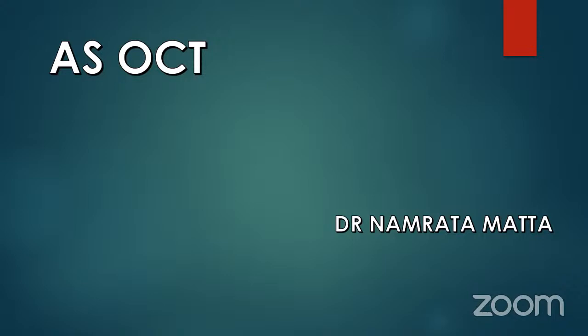Which Placido-based topography do we use? Topcon is there. Not Topcon, TOMI is there, I think. TOMI topography, and any other? In Sangli, which machine do we use? Sirius, sir. Sirius Pentacam. So Sirius, what is the technology that is used in Sirius? Sir, both the Placido disc and Scheimpflug principle are used in that.